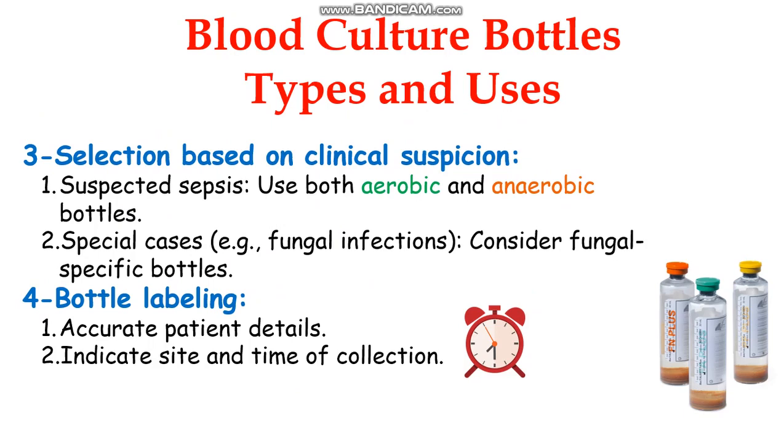When choosing bottles, always consider the clinical situation. For suspected sepsis, both aerobic and anaerobic bottles should be used to ensure broad coverage. In special cases such as fungal infections, a fungal specific bottle may be required.